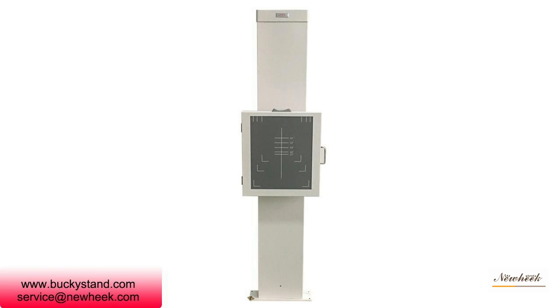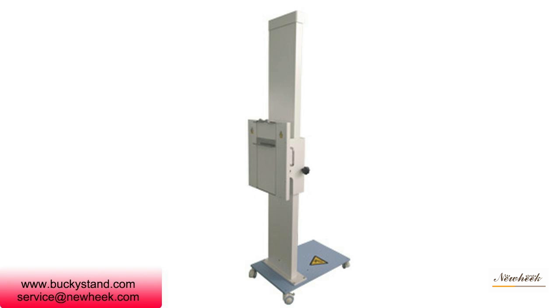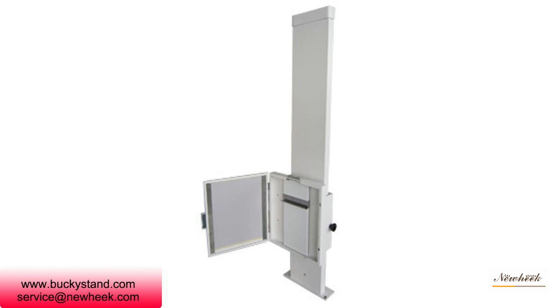Bucky's lifting methods are divided into electric and manual ones. Newheek bucky stand is divided into fixed type, mobile type and suspension type, and is easy to install. The vertical bucky stand can install a movable base according to the customer's requirements.